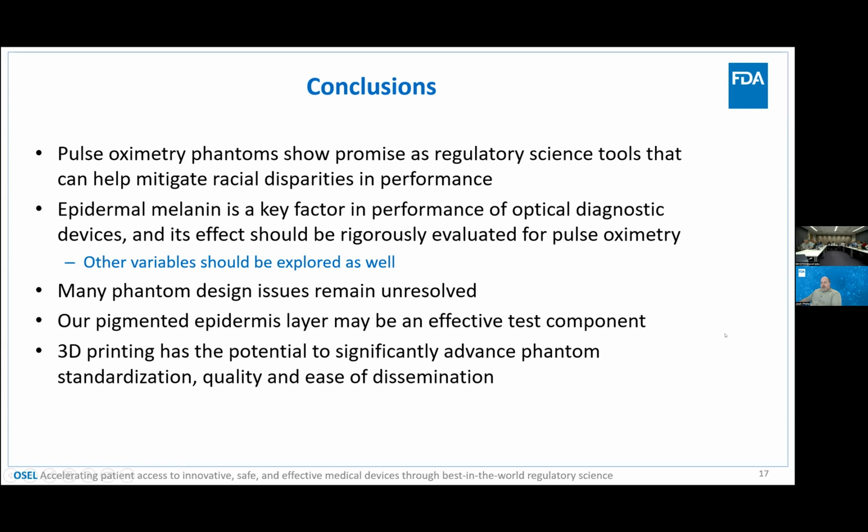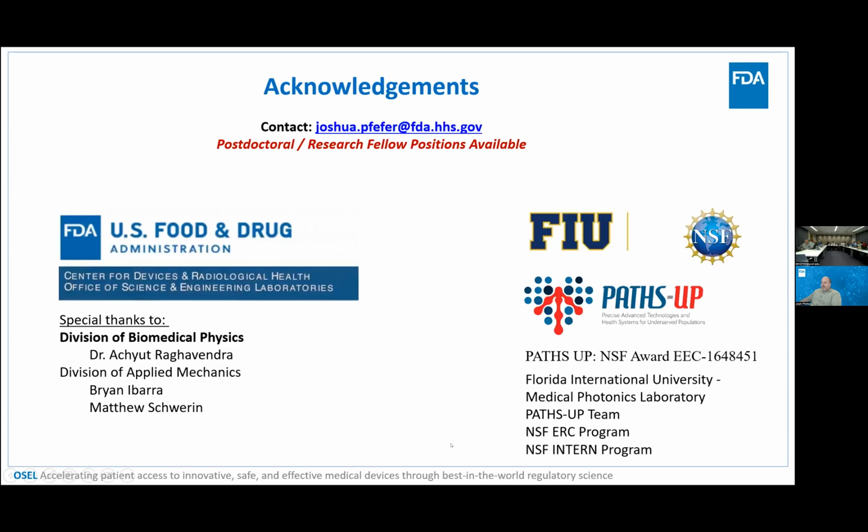Many of the phantom design issues remain outstanding, and so there's a lot of work that needs to be done. Our pigmented epidermis layer phantom from the cerebral oximetry phantom may be effective as a test component for pulse oximetry. And we also think that 3D printing has a lot of promise to advance phantom standardization and improve the quality and ease of dissemination.